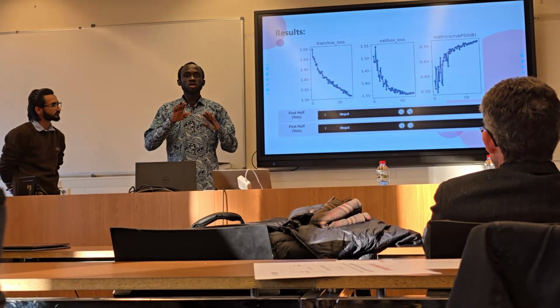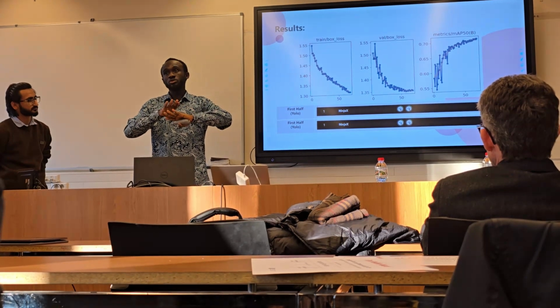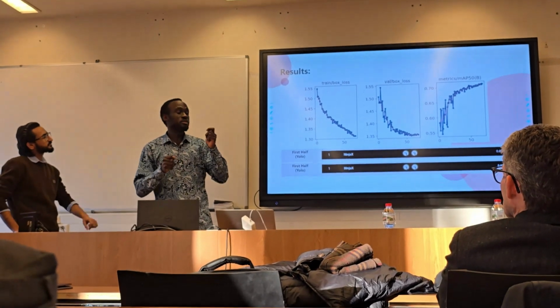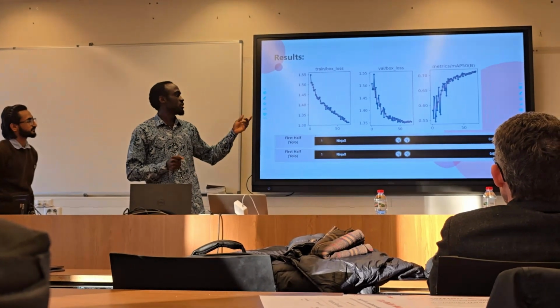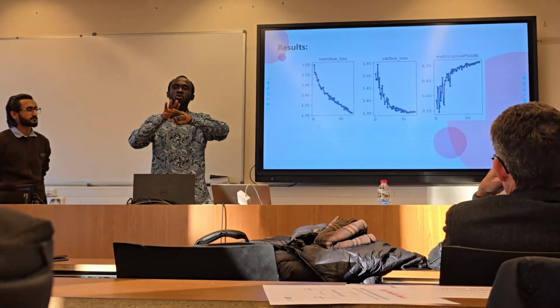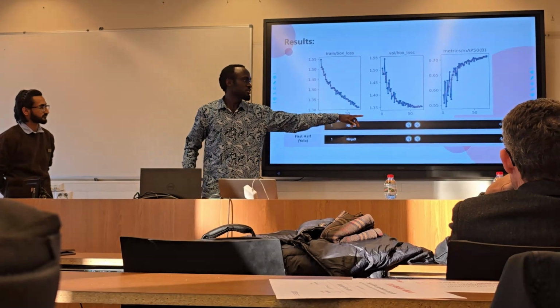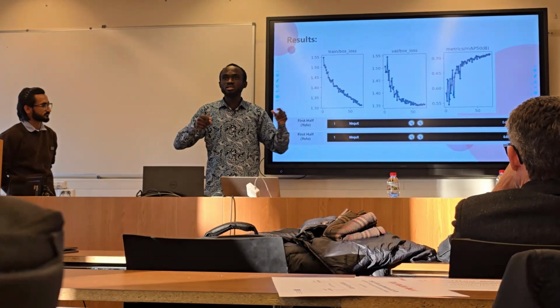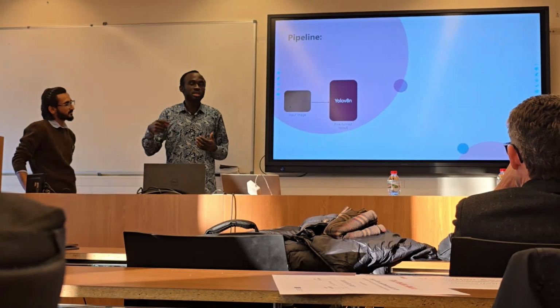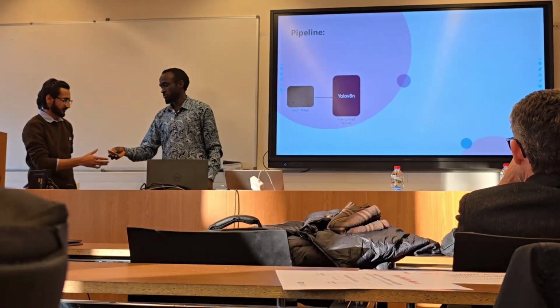We decided to have less overlapping of the ground truth that was actually detected, so we tried to tweak the IOU and the confidence to have fewer bounding boxes, because we observed that we had more overlap of bounding boxes on the patient. We did that and obtained these results after testing again with the same best model. I will now hand over to my colleague to tell us more about how we used other models to improve our classification.